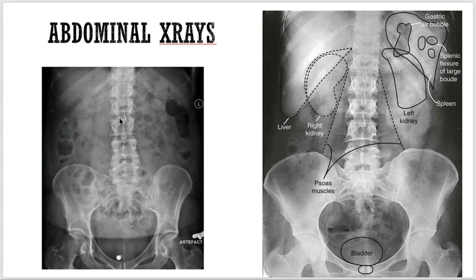So that's why abdominal X-ray is not so informative, but what is more informative is that it can guide us towards obstruction. It can guide us towards stones, gallstones, and lead to further investigation like CT scan, MRI, ultrasonography, and things like this. Okay, but if you find too much whitish thing, or very bright white thing, so remember that's an artifact, which could be anything.